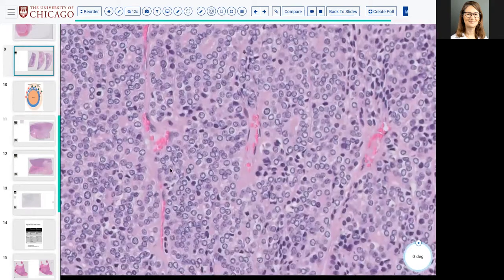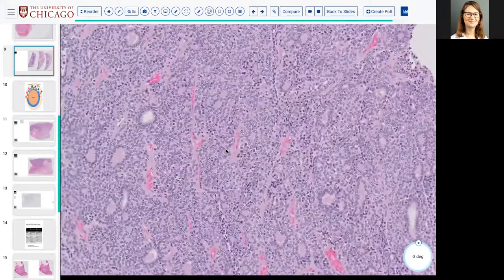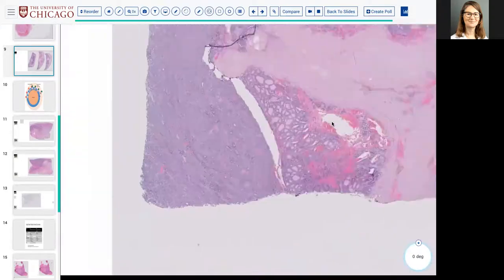I like to think of this almost like a hepatocellular carcinoma, where you have expansion of the cords, right? And lack of architecture. So I've walked through 1, 2, 3, 4, 5, 6, 7, 8, 9, 10, 11 cells without another vessel or without colloid. Yeah, this is now starting to be solid growth, okay? So that's the difference. And please concern yourself with solid growth. So when you see areas like this, yep, go back and submit the capsule.